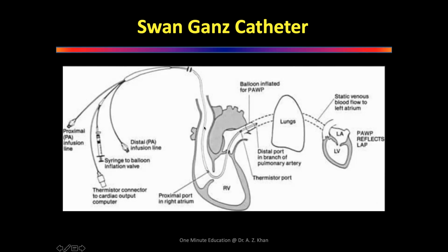So as you are floating, the PA catheter has come into the RA. What is the diagram you'll have there? Then when it comes into the RV, what is the diagram you'll have? When it comes into the pulmonary artery, what is the diagram? And what is the diagram when you wedge it? I want to see the 4 in one line. Is everybody drawing or no?